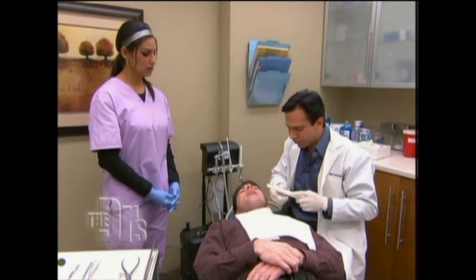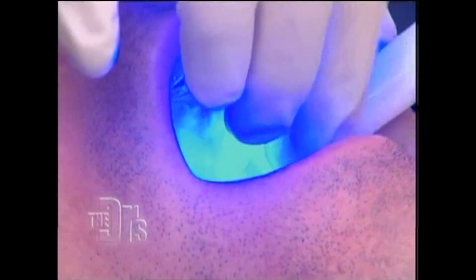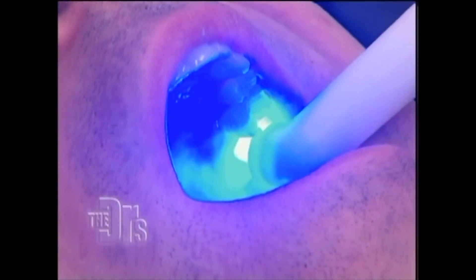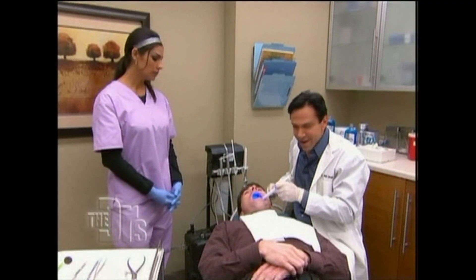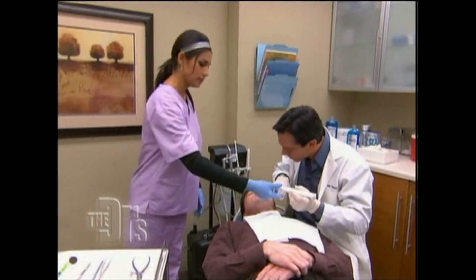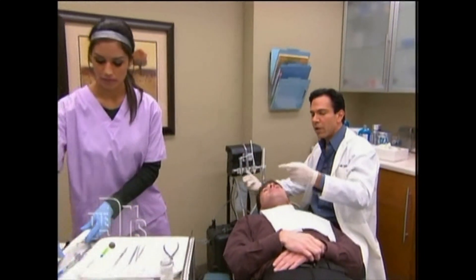Well, that looks so easy, even for the biggest dentist chickens. Yeah, and now you have no excuse not to get a crown. What we're going to do is use this little flashlight, and this will cure the cement and harden it in about 30 seconds. And of course Kevin is still numb for this part of the procedure, but we're going to un-numb him right about now. All right, Kevin, close. Awesome. Okay, let's have the Oraverse.